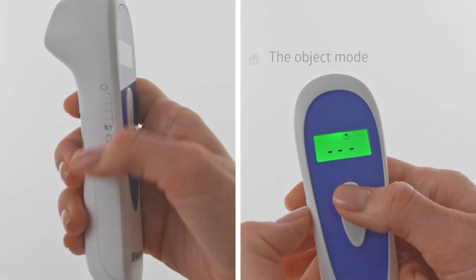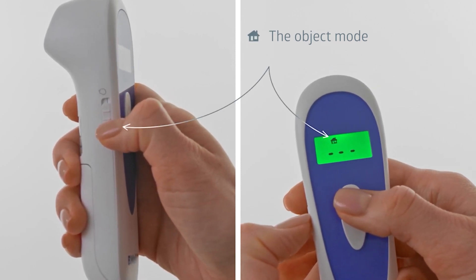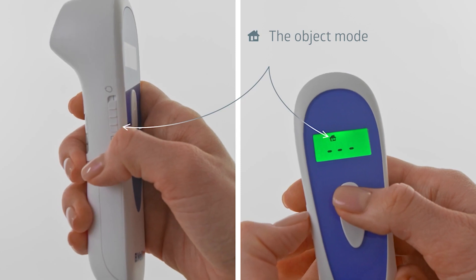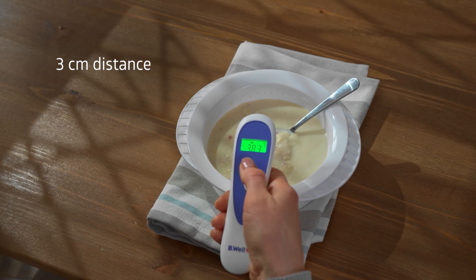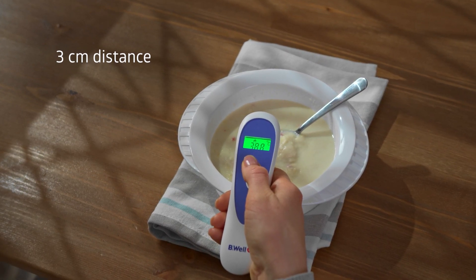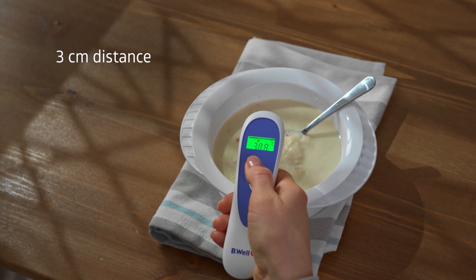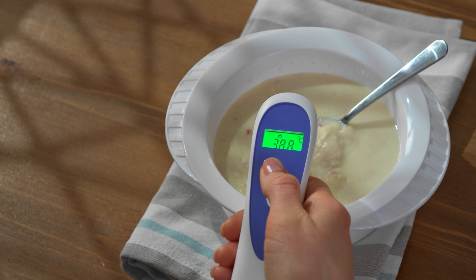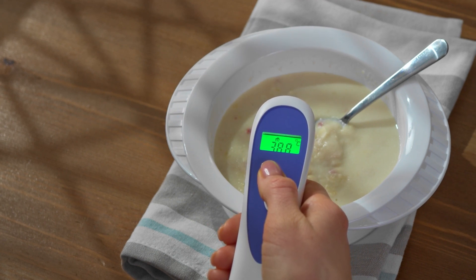Use the switch on the side of the thermometer to set the object mode. The measurement mode icon will appear on the screen as a little house. Point the thermometer sensor at the required place and hold the thermometer 3 centimeters away from the object. Press and release the on/measurement button. You will hear a short beep indicating that the measurement is complete. The measured temperature will be displayed on the screen and the result will be stored in the memory.